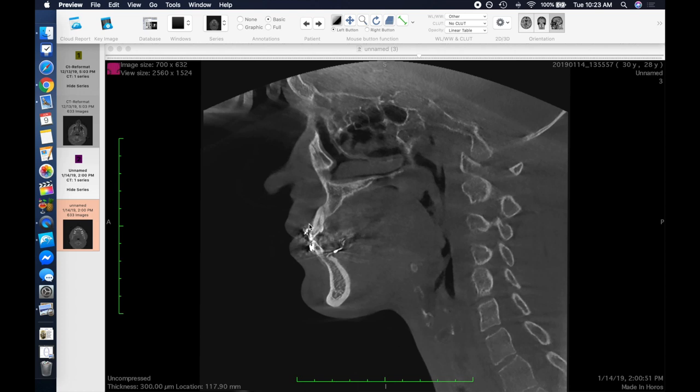So I hope you enjoyed this analysis, and I hope it serves as a caution to anyone who is considering AGGA and controlled arch braces, or who's in AGGA and controlled arch braces. Be careful. Your dentist probably thinks it's a growth appliance and will therefore be at risk of overexpanding you based on their ignorant views about how this appliance works. What you just saw is that what this appliance can do is push teeth, resorb alveolar bone, and in general damage the structures of the front teeth.